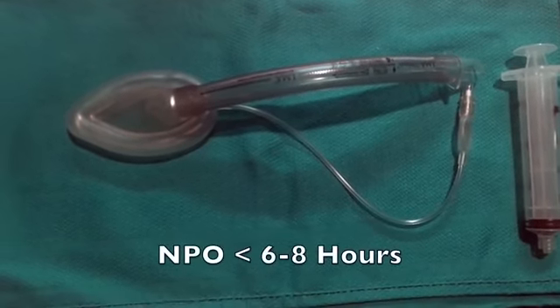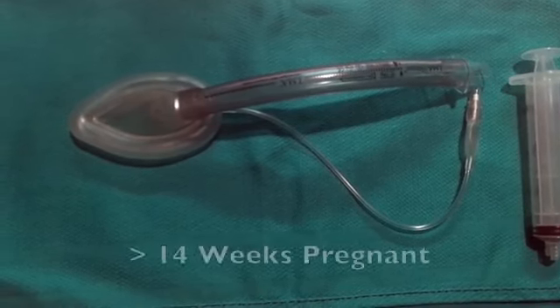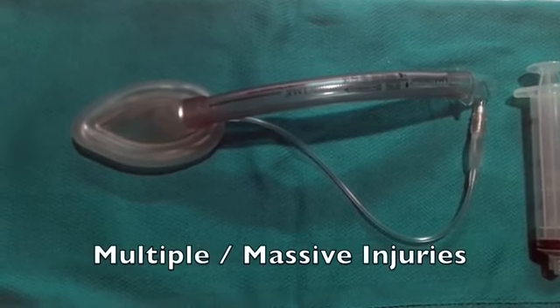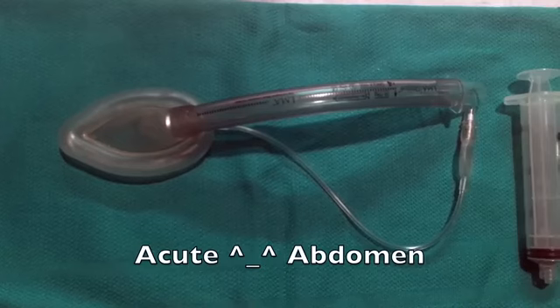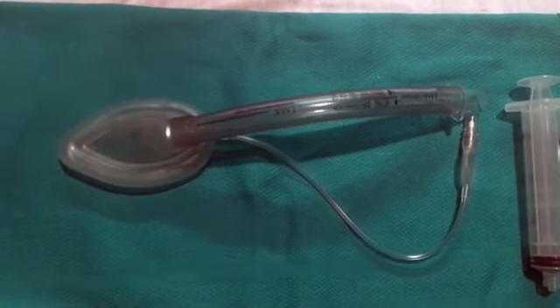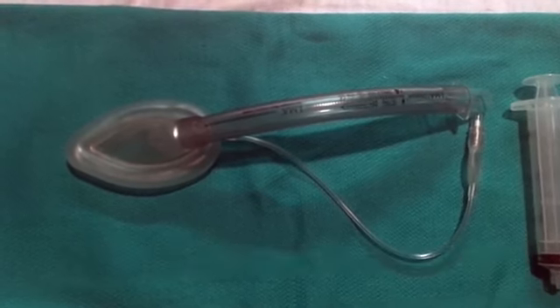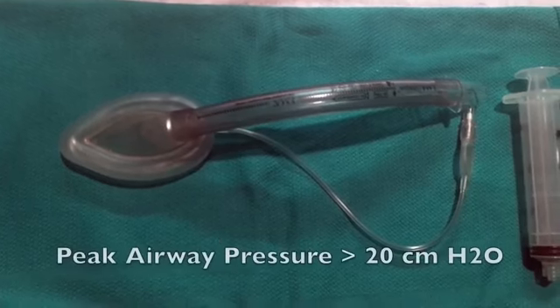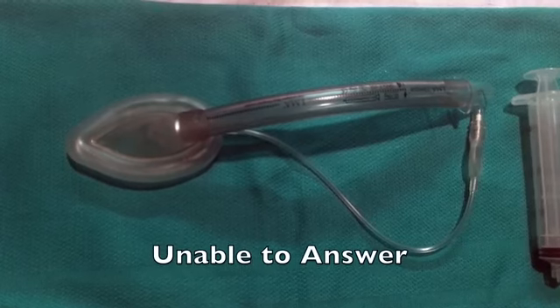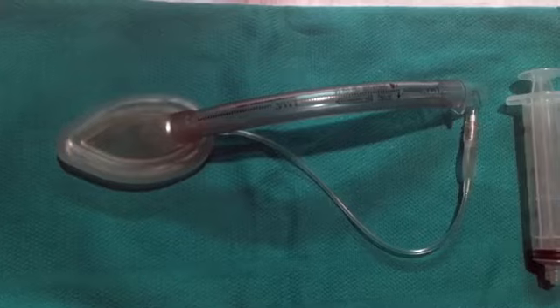If you've been NPO less than 6 to 8 hours, if you're morbidly obese, greater than 14 weeks pregnant, if you have multiple or massive injuries, if you have an acute abdomen, thoracic injury, delayed gastric emptying, opiate usage prior to fasting, trauma, if your peak airway pressure is greater than 20 centimeters of water, and if the patient is unable to answer or understand questions about medical history. Those are just some of the contraindications of using an LMA.